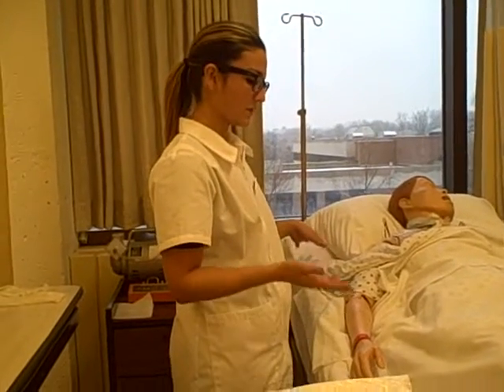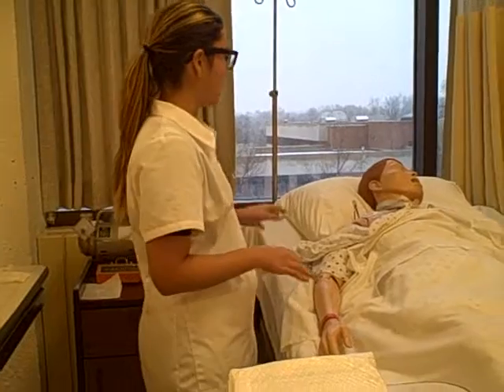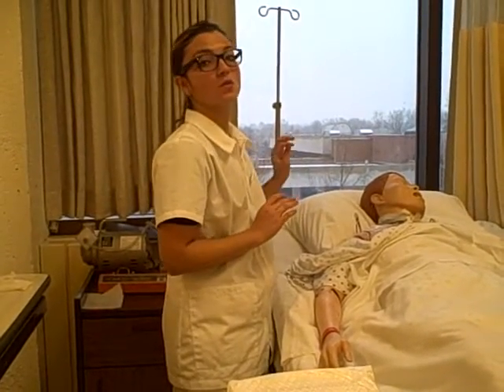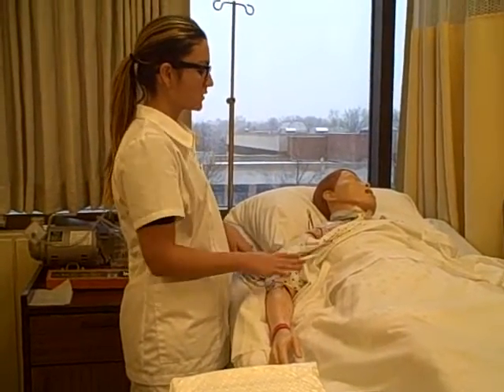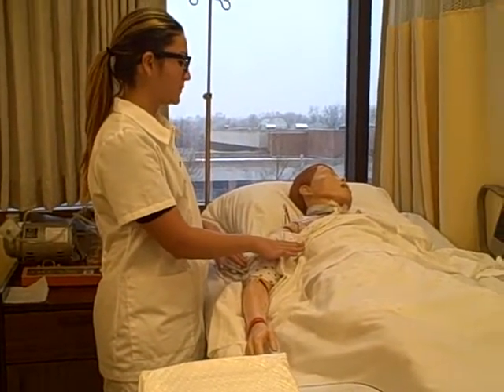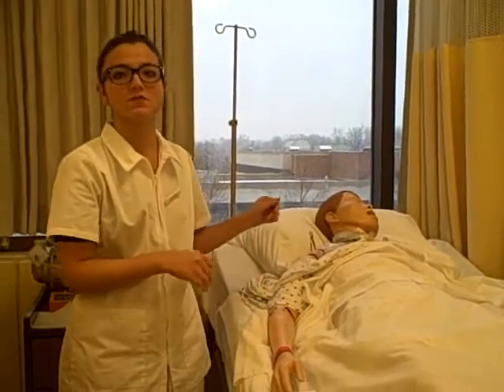So we want to make sure that the head of the bed is raised just a little bit, and of course that the bed is raised at a comfortable position, at a working height. We want to make sure for this validation that the patient's head is turned away from the site, so he's not breathing on it. We're going to drape the patient, and we're going to assess for infection, make sure that there's no drainage, and just make sure that there's no sites of infection.